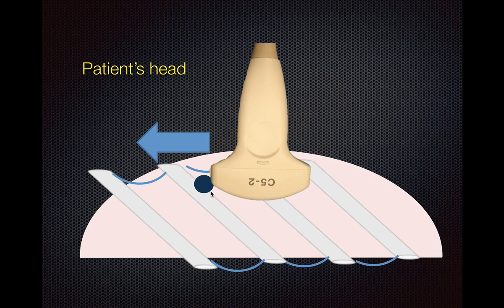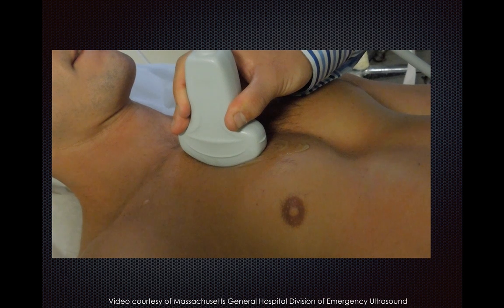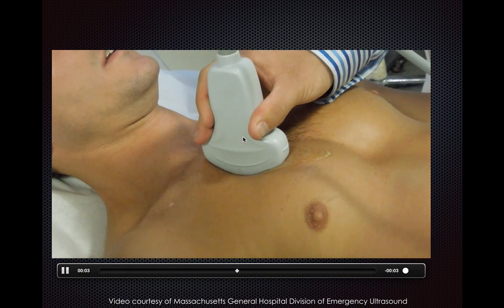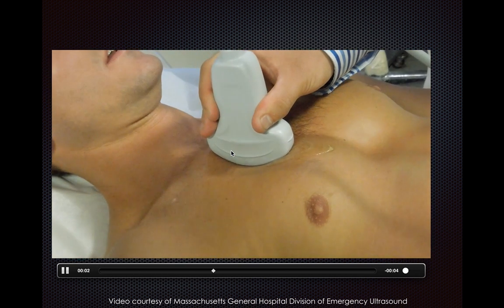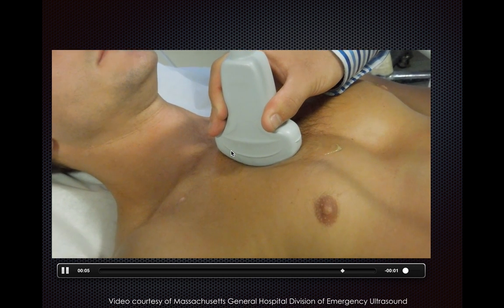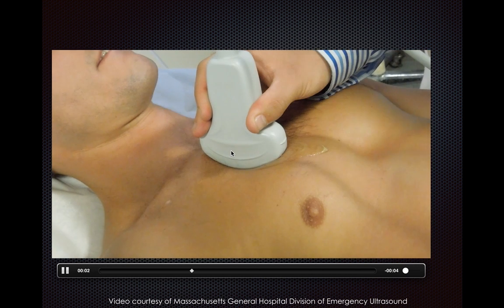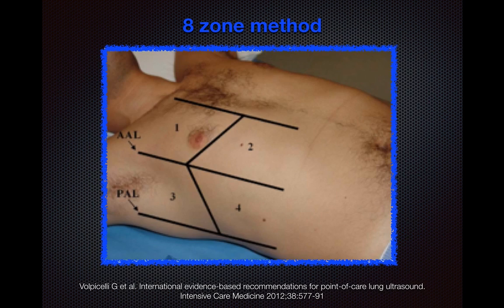You can use any of the transducers, but we highly recommend the curvilinear to start. When performing lung ultrasound, place your transducer longitudinally to identify two rib spaces. You want to image between the two ribs while ensuring the actual ribs are visible in your image — a longitudinal image is what you want to generate. By convention, place the transducer marker towards the patient's head.